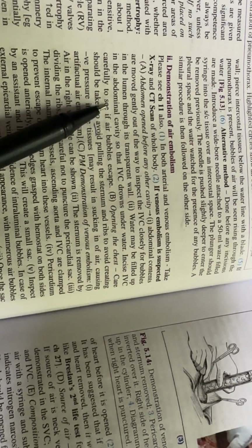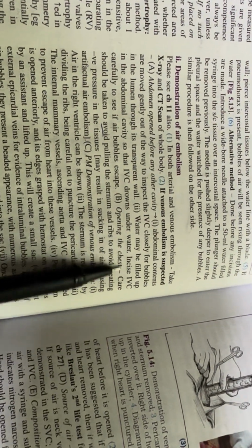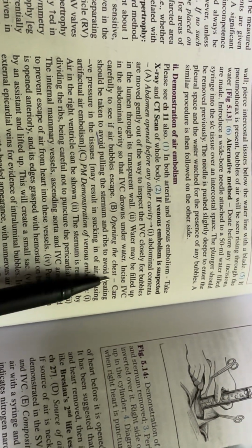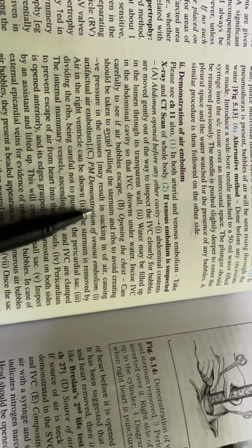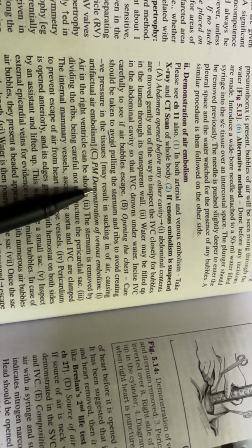Water may be filled up in the abdominal cavity so that the inferior vena cava is under water. Incise the inferior vena cava carefully to see if air bubbles escape. When opening the chest, care should be taken to avoid pulling the sternum and ribs, to avoid creating negative pressure in the tissue, which may result in sucking in of air causing artifactual air embolism.